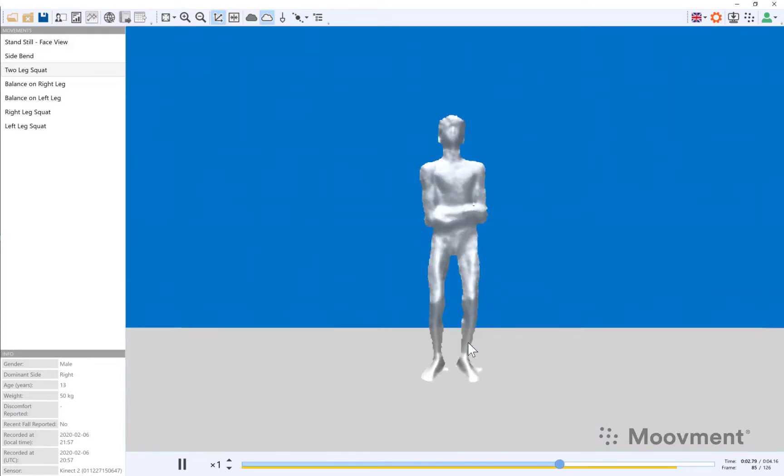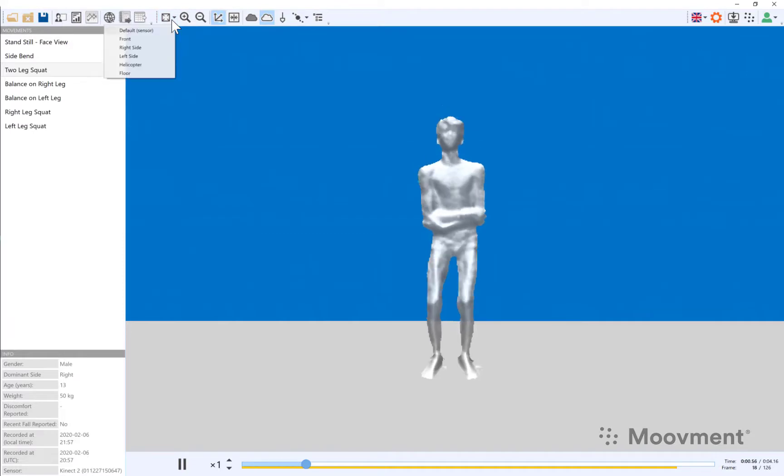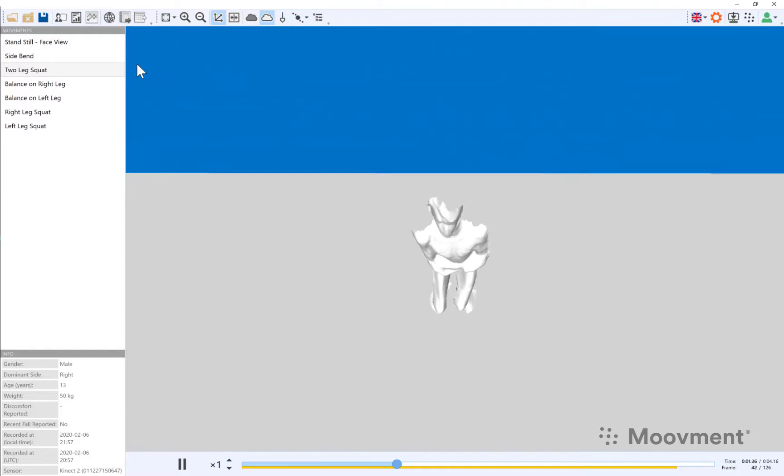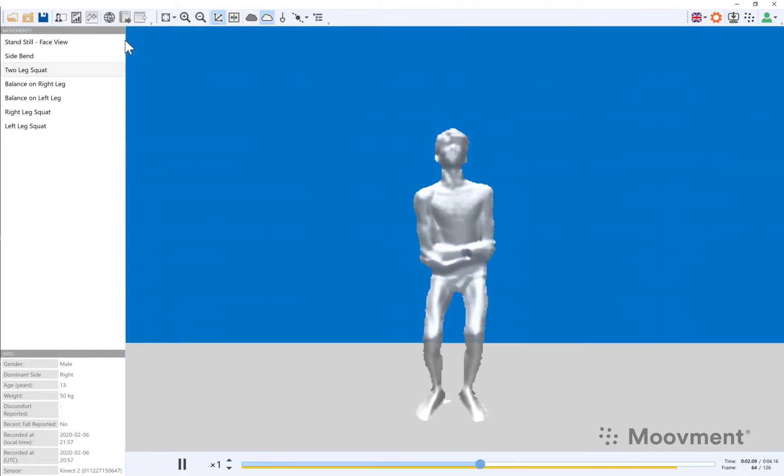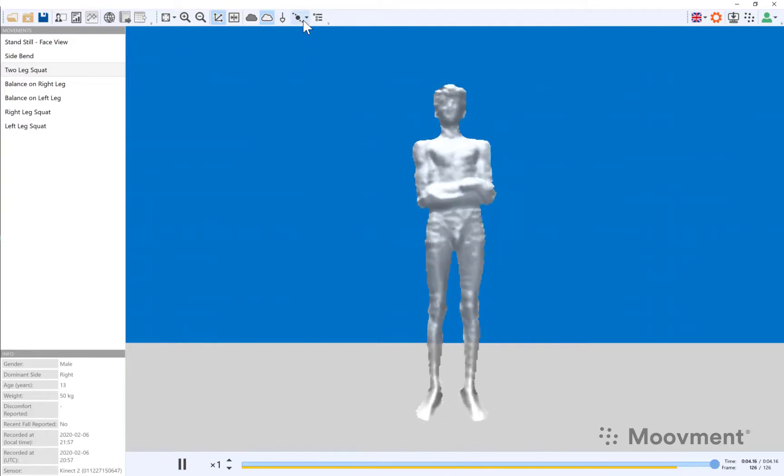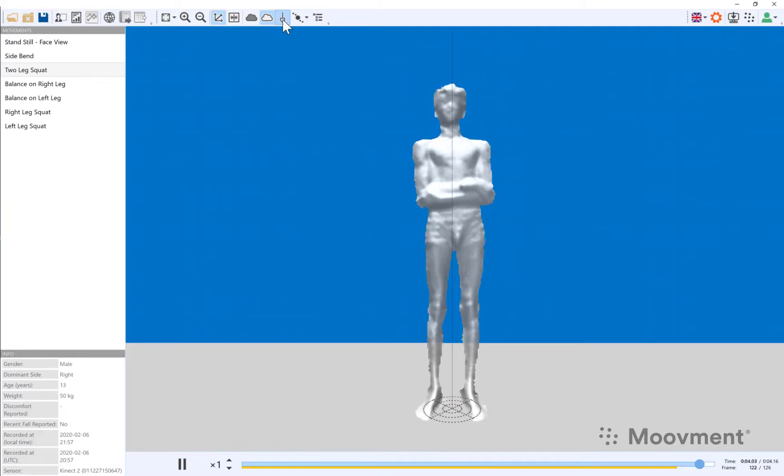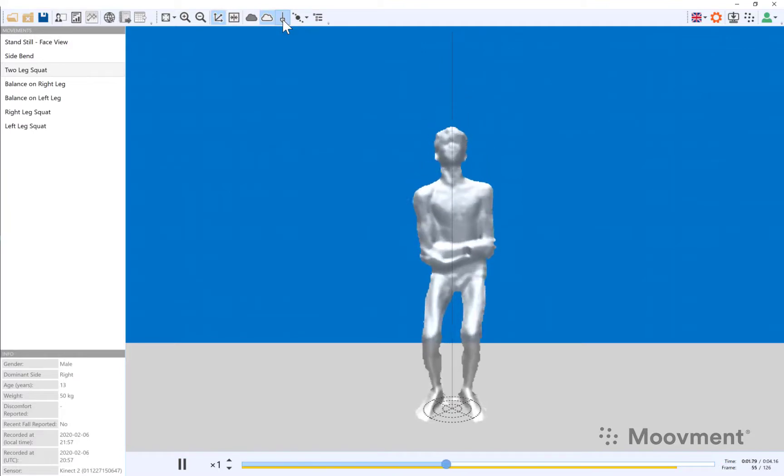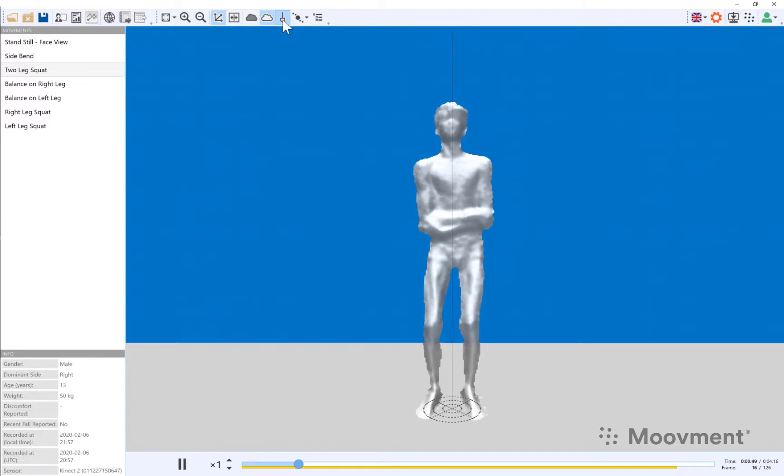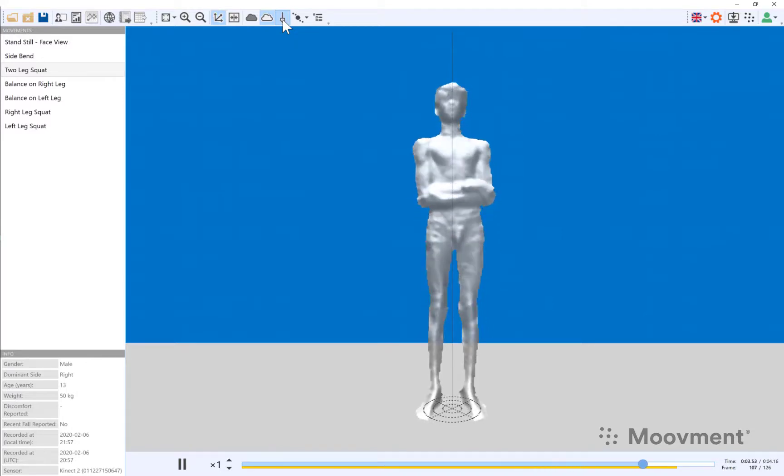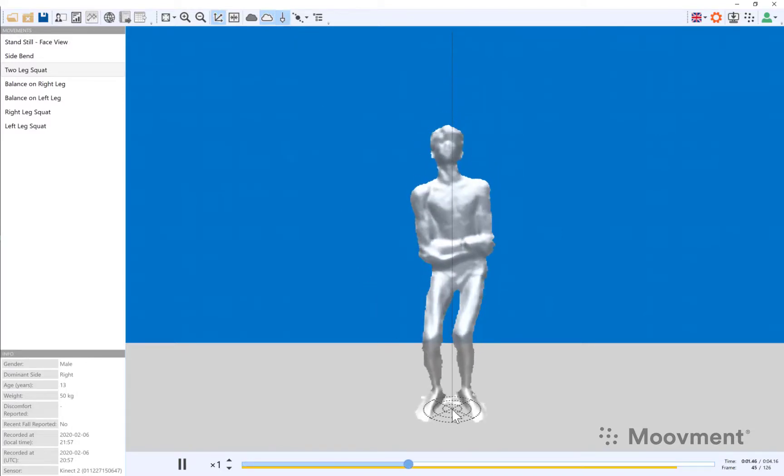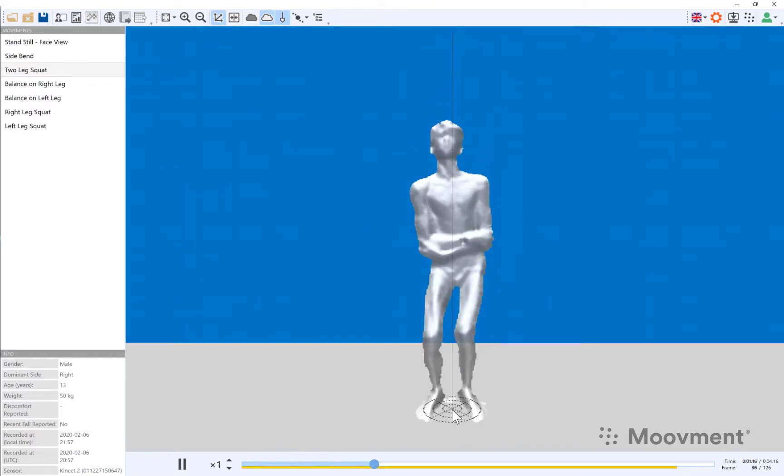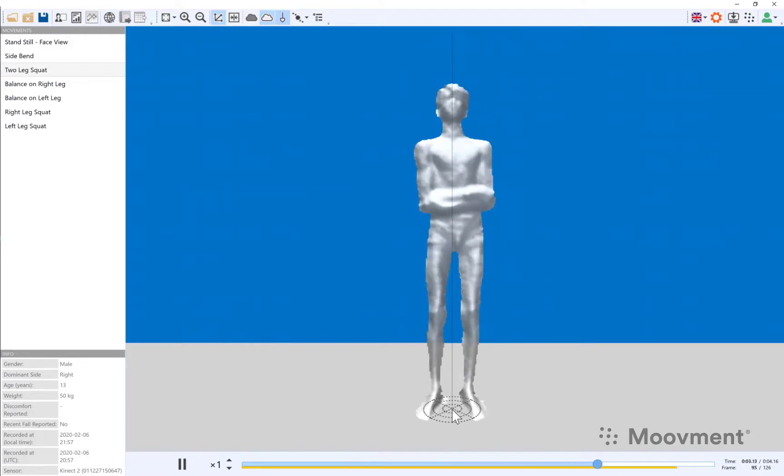It's possible to toggle through all of these by switching on the perspective that you would like to see. Let's stick to the front for now and let's look at some reference points so that we can orient ourselves with gravity. You can see his base of support here and the line of gravity which is projected up from the middle of his ankles.